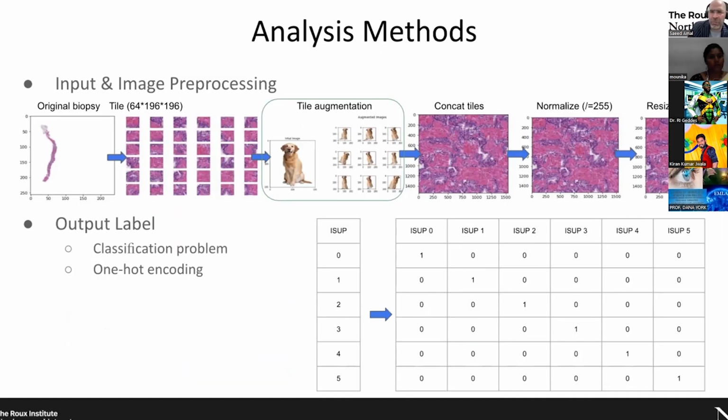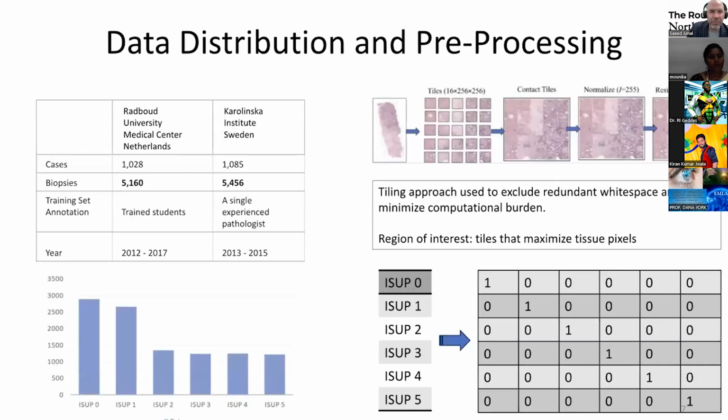So of course, this problem could be solved either by binary classification of each one, and then based on the score of the sigmoid for the positive class, we choose the most dominant one, or we can do multi-class classification where we can see the probability of each one of those grades.